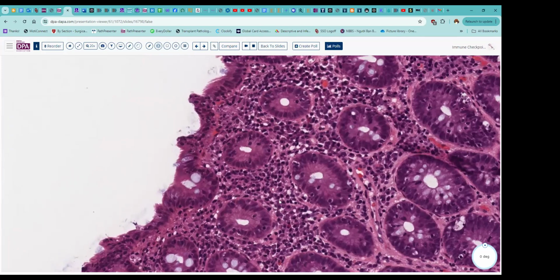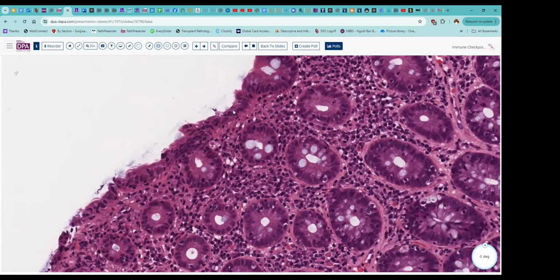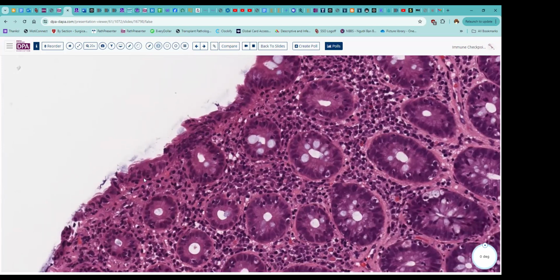Collagenous colitis is the second flavor. And then just a general microscopic colitis where you've got sort of indistinct, not otherwise specified damage to the surface epithelium, some evidence of maybe some increased lamina propria plasmacytic inflammation, and these other features.